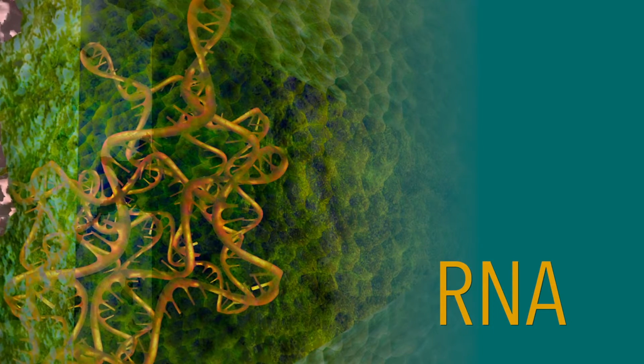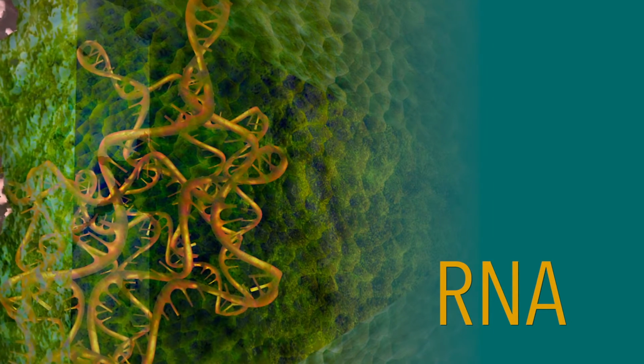As part of this project, in addition to direct detection, we also developed a platform that allows us to discriminate between different strains of the virus. Differences between the RNA sequences of the different strains tend to be very small. What the CRISPR system allows us to do is to distinguish between those very small differences. So you can discriminate to identify, is it an African strain or is it an American strain or an Asian strain?